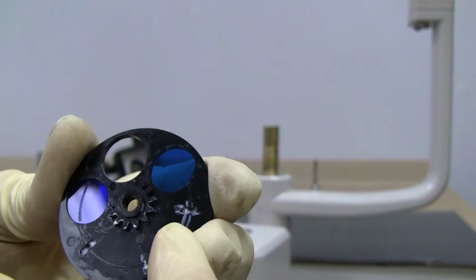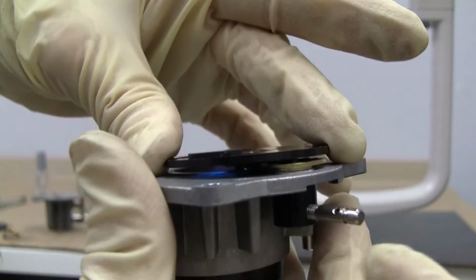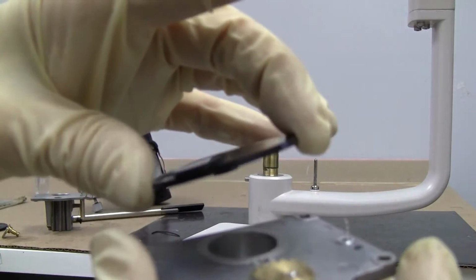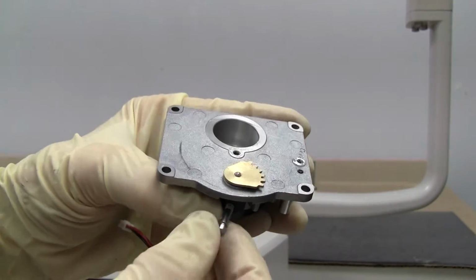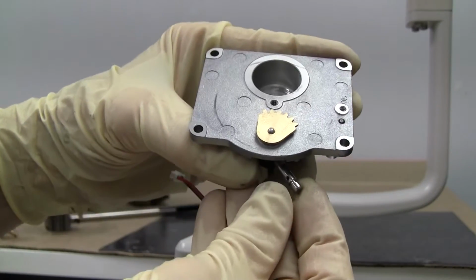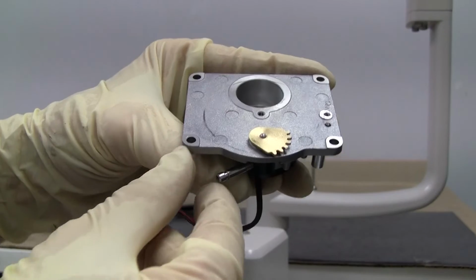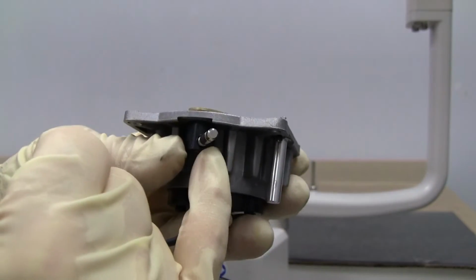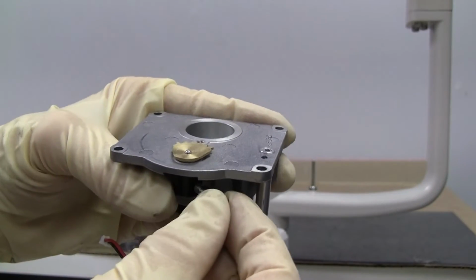Something must have happened in here. Perhaps when it was worked on before, it wasn't put back together the correct way. So we'll have to clean this filter off and put it back together. I think I know what happened here. It had gotten so far off that where the gear should have been in the middle, and it was adjusting like that, we were all the way over here, so that when we were trying to turn to the next color, it was going completely off of the gear. So the real issue was that it had gotten so far off center, and that's why it wasn't working.